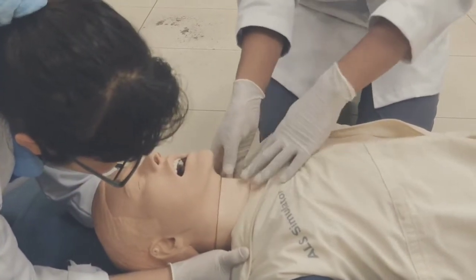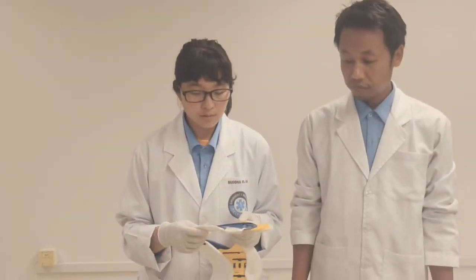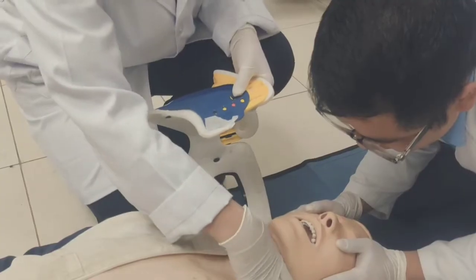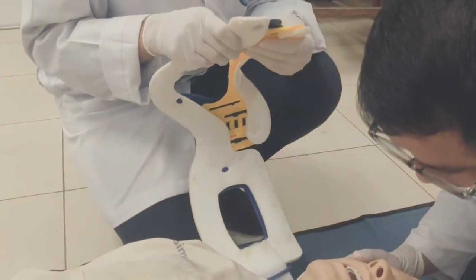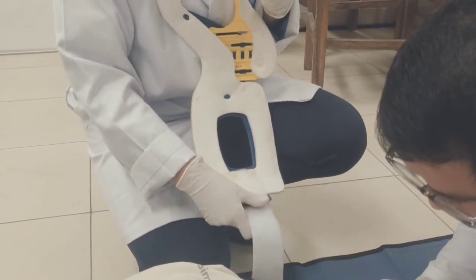Then my friend will immobilize using a cervical collar. To use the cervical collar, first we have to measure the patient's neck and size the collar. Then we have to apply the collar without moving the head.